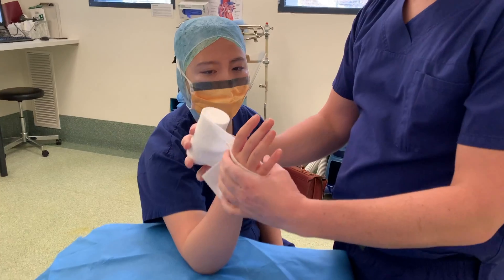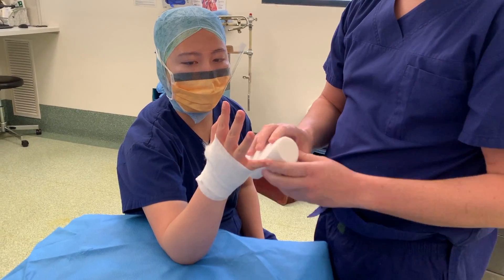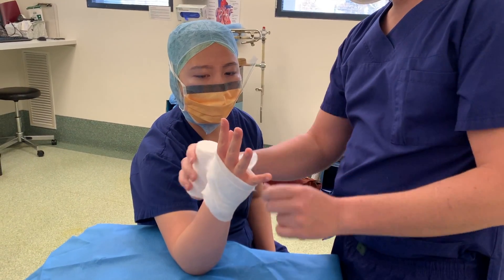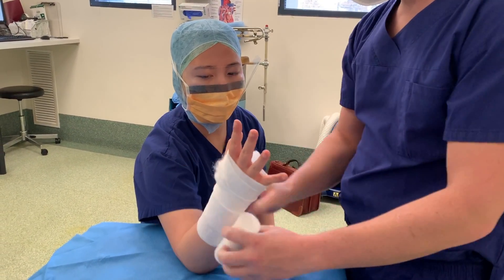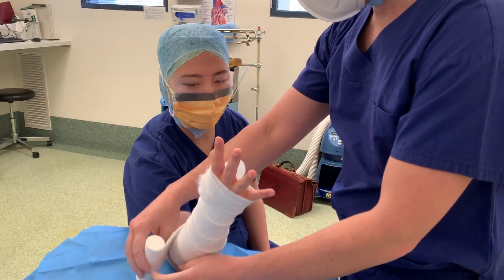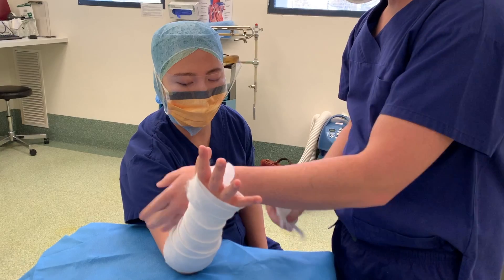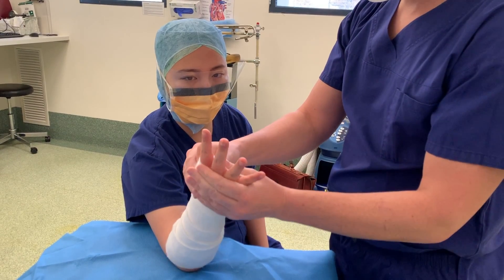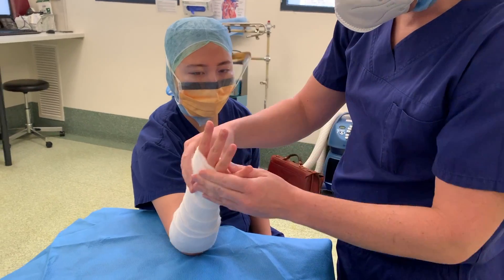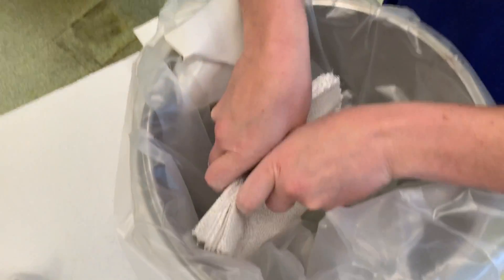The next step is to apply padding. We're using the 10cm size softband in this video. We start by making a small hole in the middle for the thumb, then place the thumb through and begin wrapping around the arm with 50% overlap each time to ensure adequate padding. The application should be firm but not tight. The softband has to cover outside to where the plaster will be, so we can fold it back onto the plaster later.